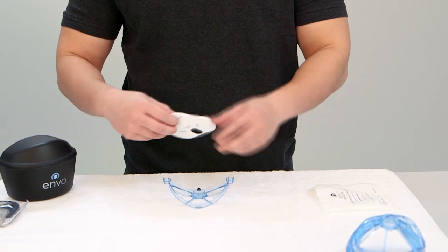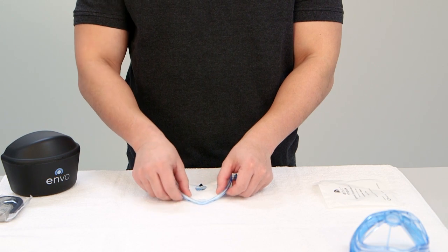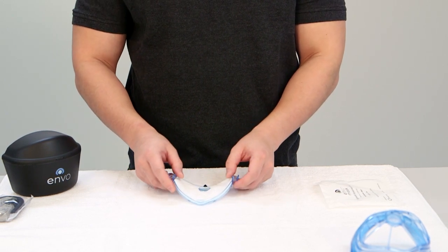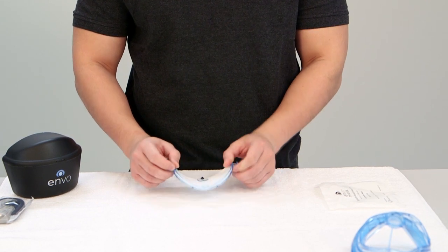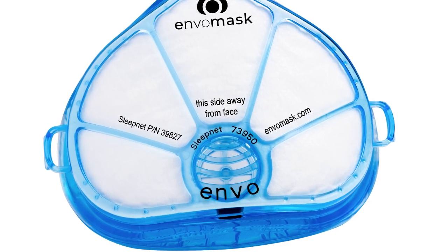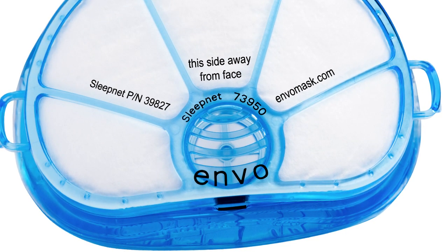Place the filter cover on a flat surface and insert the filter inside the cover with the printed side face down. When wearing the mask, the printed side should be visible to others. Make sure the filter is installed completely and laying flat. Observe that the filter cover is secured onto the fine grips, which look like dots along the edge of the filter cover.